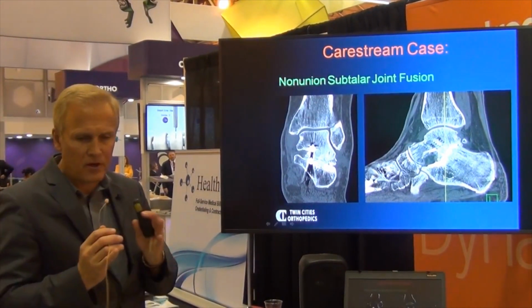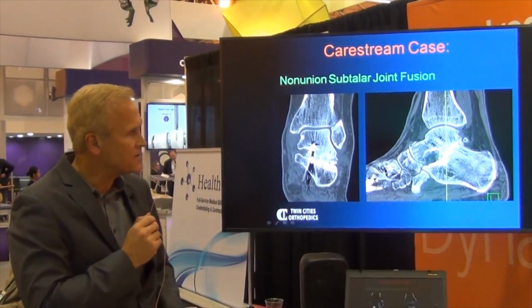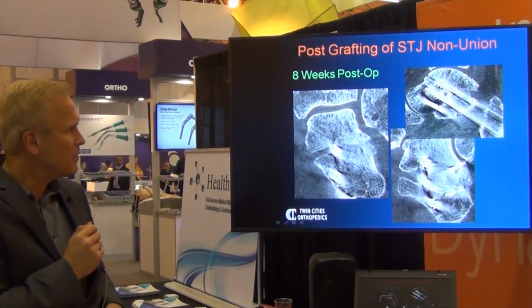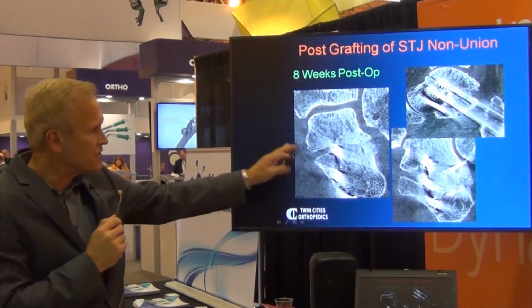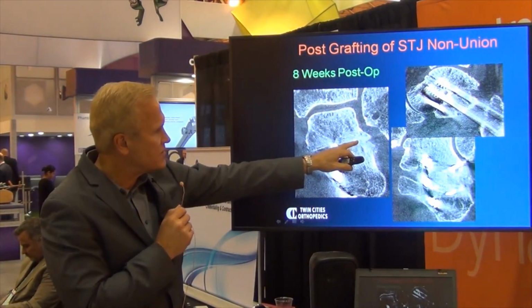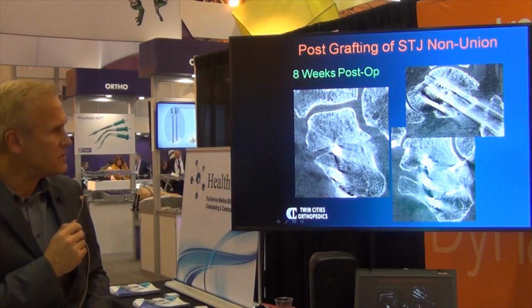Had persistent pain in the medial lateral aspect of his hind foot. He had a clear non-union on the CT scan that was done. And then post-operatively, once I did another grafting procedure and added some extra fixation, a staple and another screw, you can see that now he has trabecularization across the fusion site here and here. And so his pain was gone at 8 weeks.